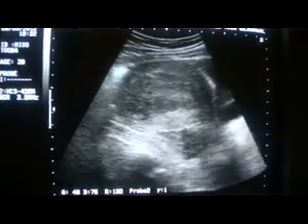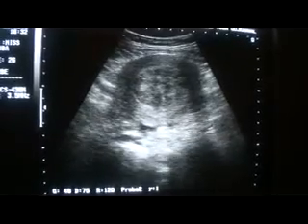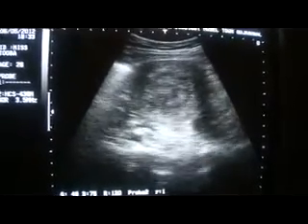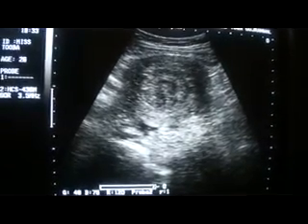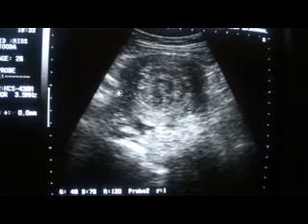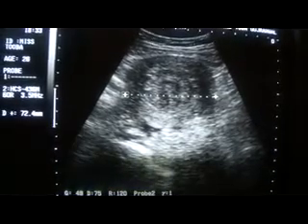Now, lengthwise, the endometrial canal is dilated up to 6.1 centimeters. In anterior posterior diameter 3.8, and in this dimension 4.3 centimeters. This is a significantly raised, enlarged diameter.